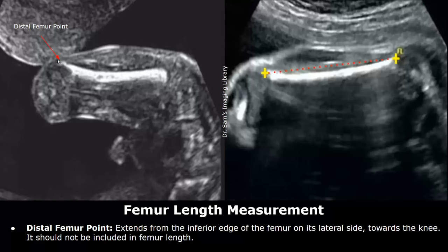If you see this sharp edge of the femur near the knee, do not place the caliper on this sharp edge.